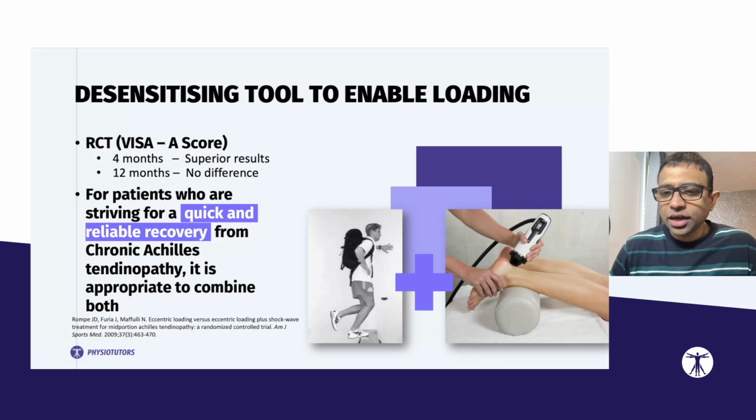And also, at the end of the day, it's all about getting them back stronger and loading the tendon. And Shockwave is a modality which will help you to do that, to do the exercise with less pain so that they can take more load, and then we can have more tendon adaptation.